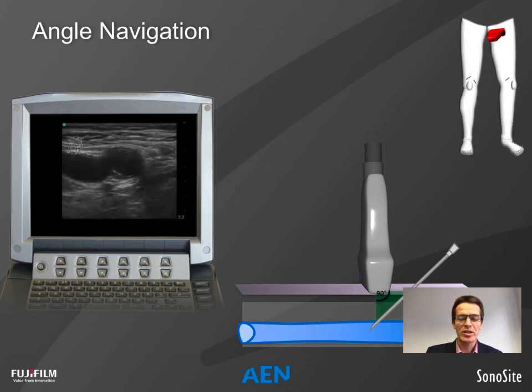This is a vascular access in a femoral artery on the left side. You see in the ultrasound film that there is some tissue movement in the 12 o'clock position right now, and then you see the needle tip being inserted into the artery, and then here again you see the guide wire being inserted on the spot, so it was pre-positioned. So we look at it again, you see the motion of the tissue, you see the needle tip and the guide wire. So it's a good method.